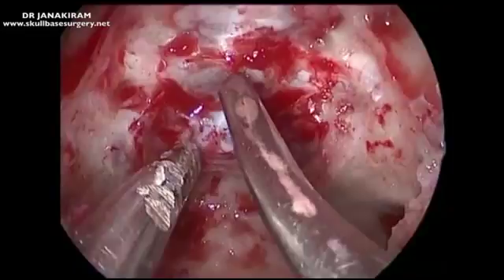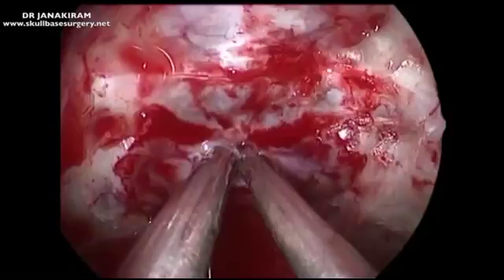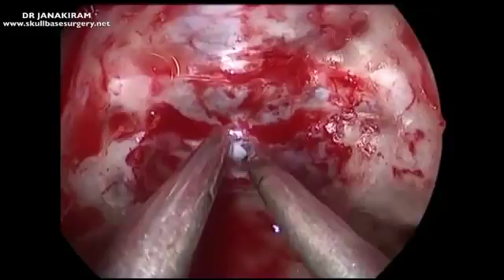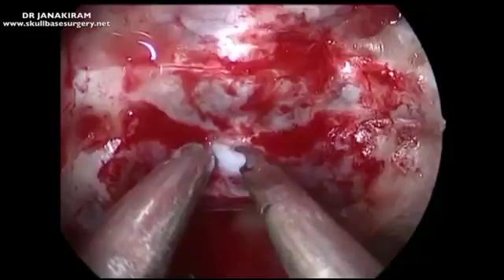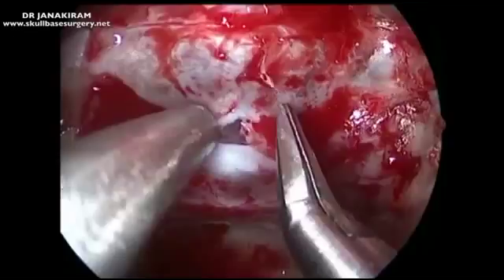Having known the limits of our carotids, I am now using the retractable Capabianca knife to make an incision. Once we make the incision, we raise a flap. The pituitary gland is pushed downwards in this case.